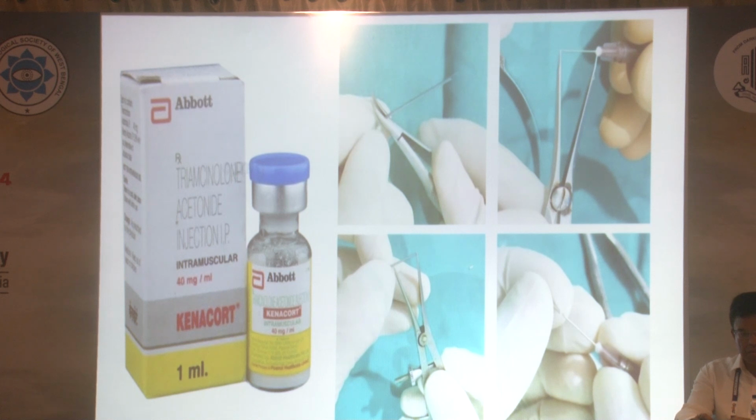So we here adopted a novel technique of designing an innovative injection system for suprachoroidal injection. We have taken a 22 gauge needle from just a simple IV set, and a 26 gauge needle which is available in each OT.